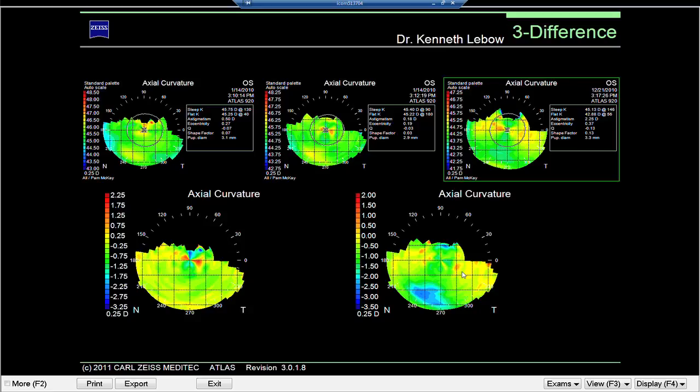Beth is a great patient — a little plug for her: she's in optometry school. It's been a pleasure to work with her and demonstrate how we use corneal topography in a very straightforward, basic, simple situation.